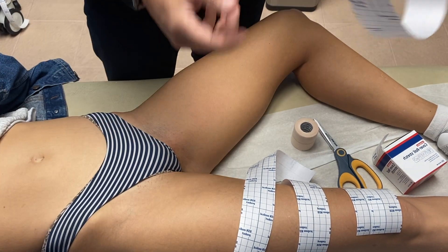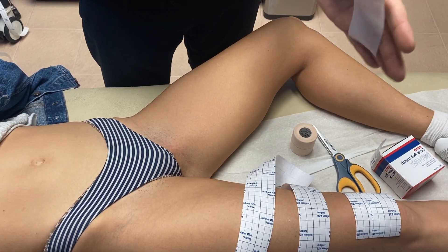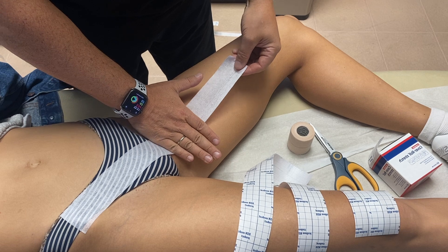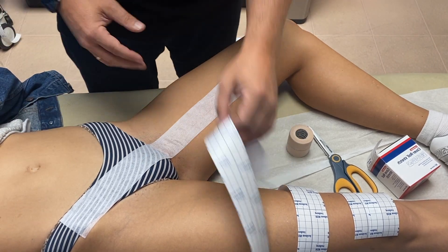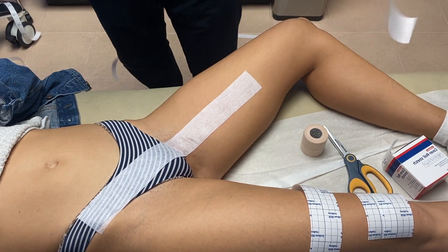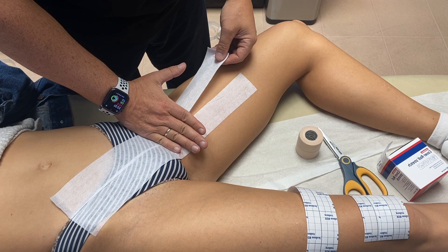You've got an 18-inch piece of tape that can't stick to itself, so spread your fingers out very quickly. Smoothly separate the backing from the tape, then place that tape on the ASIS and identify that adductor longus tendon. We don't want any excessive stretch on the cover roll stretch — we want some stretch to it. Put the next strip just right over the top of the previous one, being careful that we don't have any skin opening between the two tapes. Gently make sure it gets all the way down to that inguinal crease.